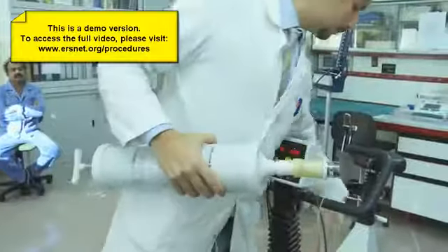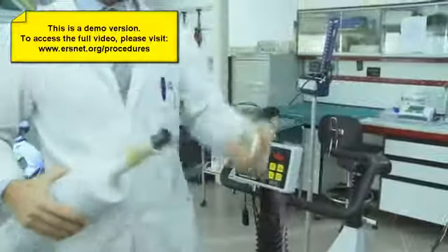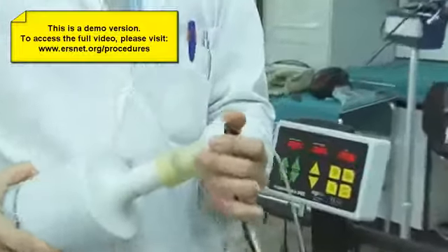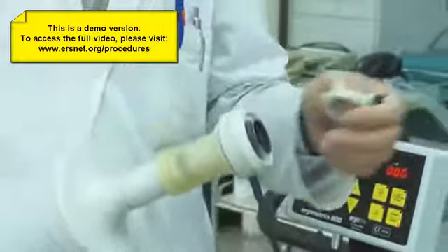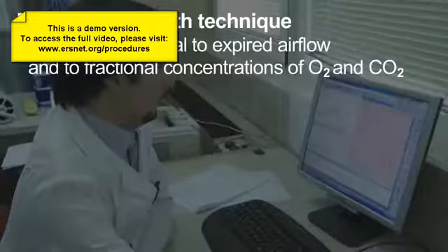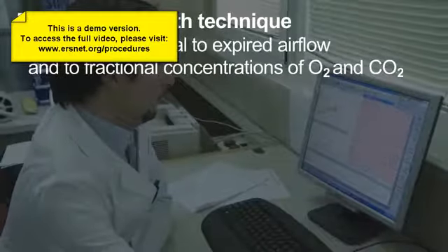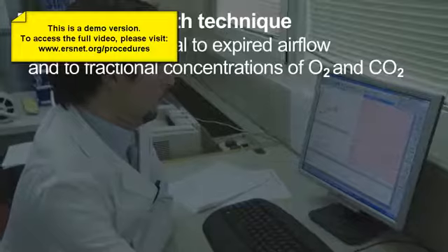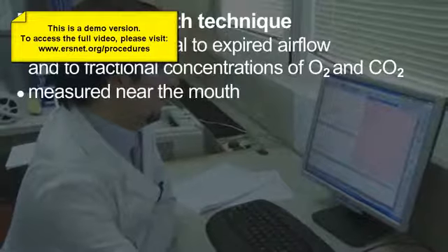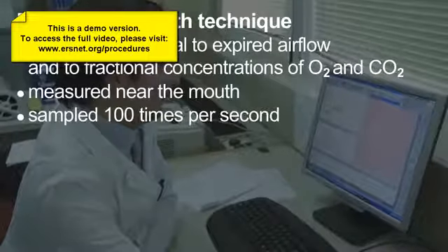A central focus of CPET is the measurement and interpretation of gas exchange. Several techniques are utilized to measure or compute VO2 and VCO2. In the breath-by-breath technique, signals proportional to expired air flow and fractional concentrations of O2 and CO2 measured near the mouth are sampled 100 times per second.